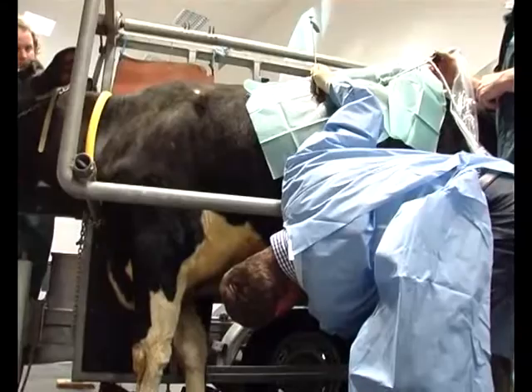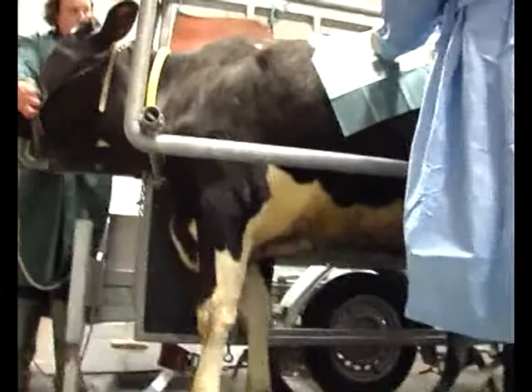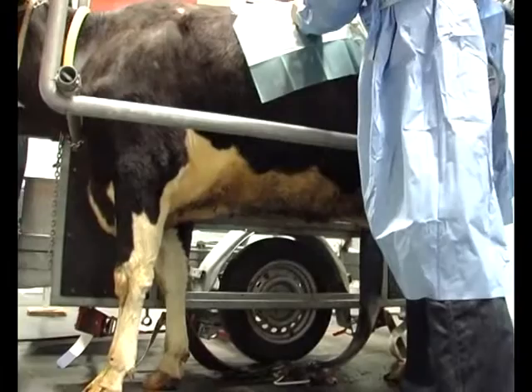Now this is quite far from optimal because it is not straight, and I'm not used to use with the bended version. If the bended version, if I start to push, then it goes that direction. So that's not what I want.